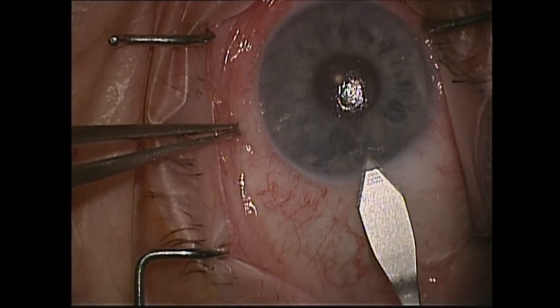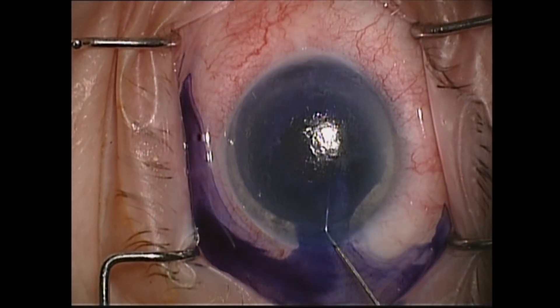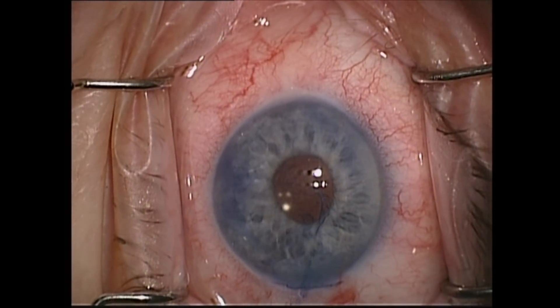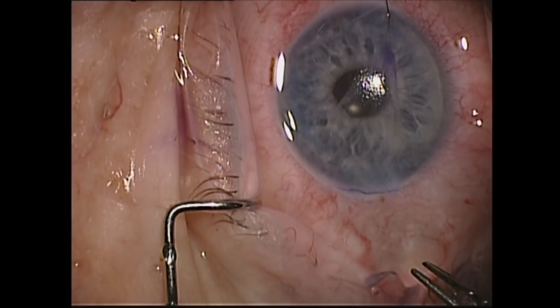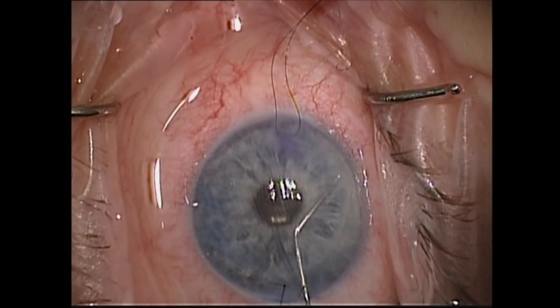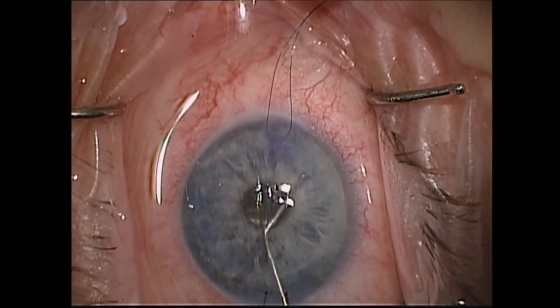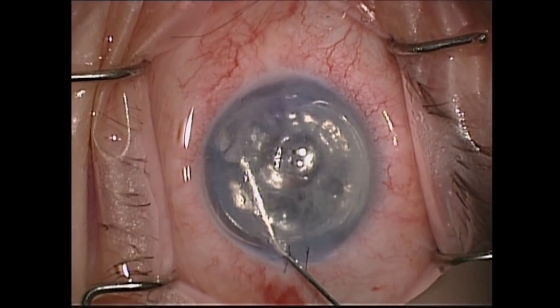On the patient eye, a small entry is made in the side of the eye. The eye is then filled with a staining fluid to stain the back surface of the cornea so we can remove this tissue. The donor tissue is then pulled in to replace the tissue we've just removed, and it's unfolded with a salt water solution. Once unfolded, this donor tissue is positioned in place with an air bubble — it's pushed up against the back of the cornea.